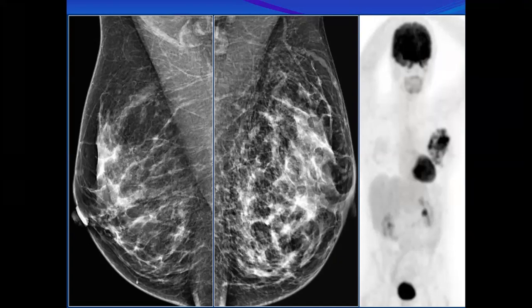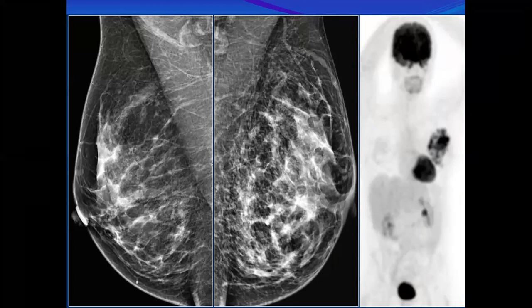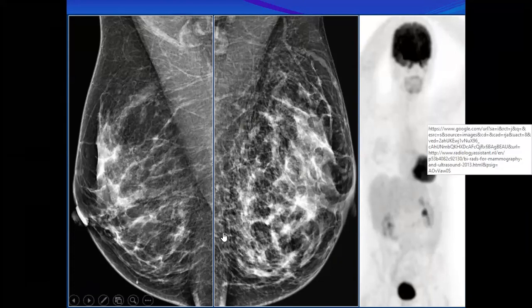Any suggestion? Do you agree? I think the smaller one, I disagree. The smaller one is usually more suspicious, because usually in inflammatory carcinoma the patient presents with a smaller breast. Yes, there is infiltration of the lymphatics of the breast, overall breast. Yes, shrinking of the size of the breast. Yes, this here, the infiltration of lymphatics causing the trabeculations and the prepectoral area. This area is rich in lymphatics also, giving this edema here.